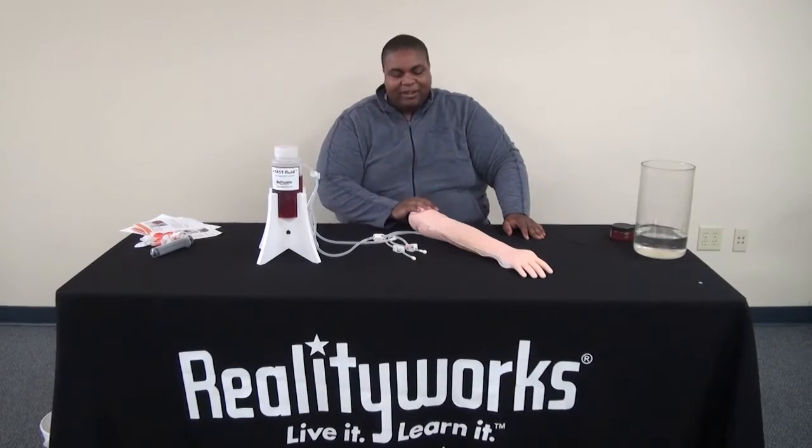Hi, I'm Nathan here with product support at RealityWorks. We're just going through connecting your fast fluid system to one of your training arms today.